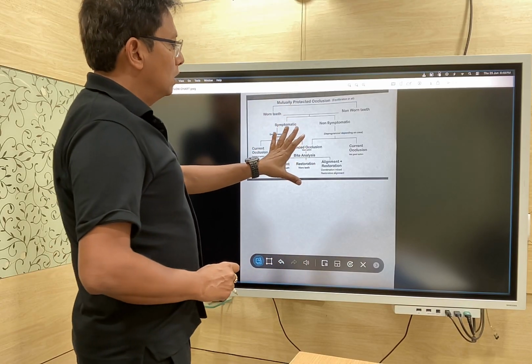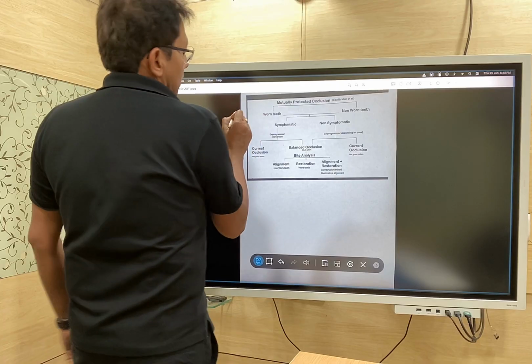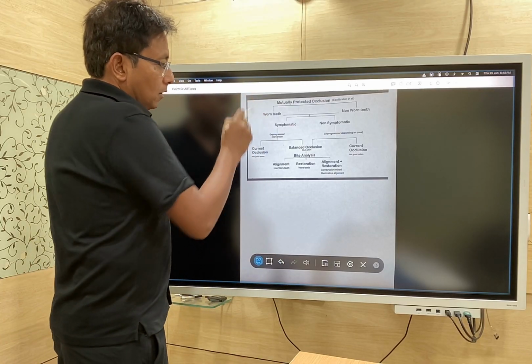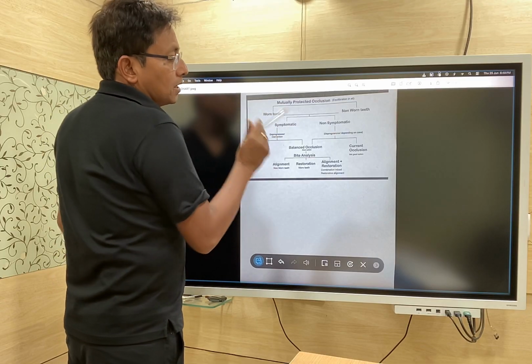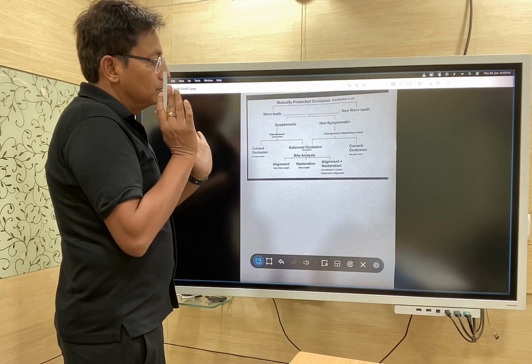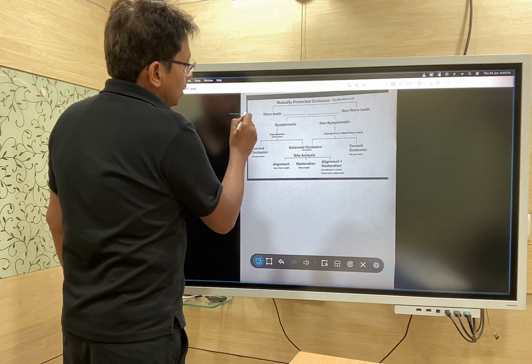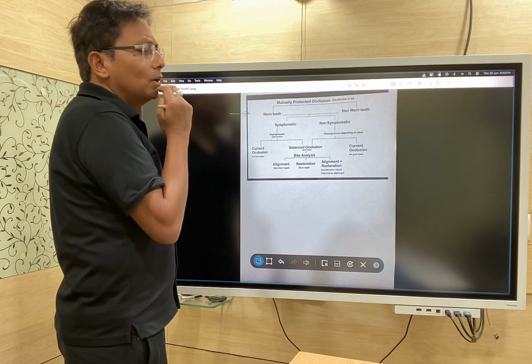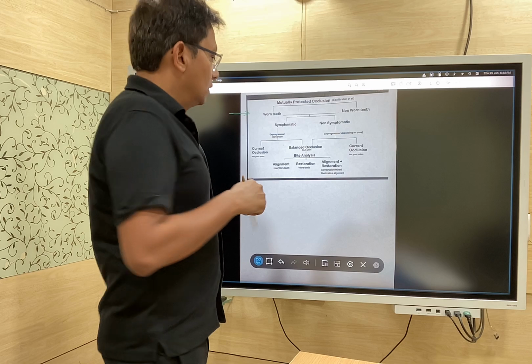Treatment options for worn teeth, you can categorize in two categories only for people. Now, for worn teeth status, you have to check whether patients have extra oral symptoms or not. By doing a 3D scan, you can check and see whether teeth are worn or not: canine tips worn, multiple teeth, cusp tips worn, facets are there, or the occlusal signs.